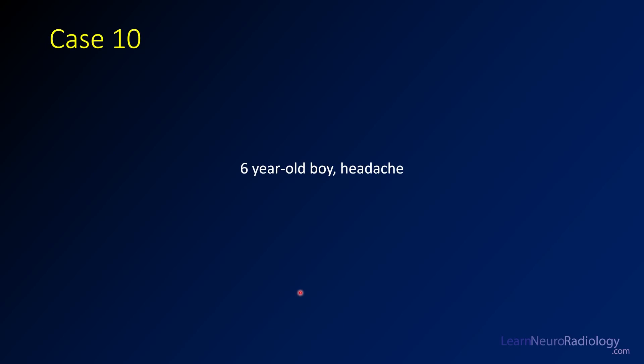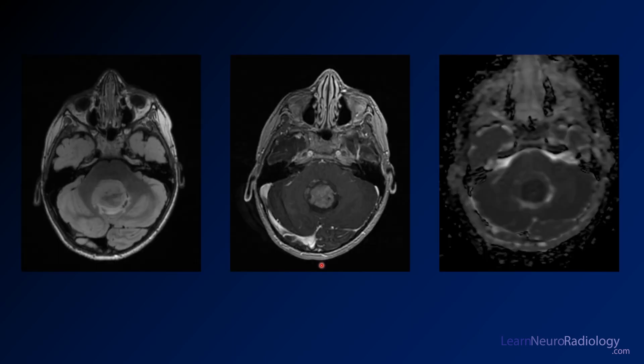Welcome back to Learn Neuroradiology. For case number 10 of our brain tumor board review, we have a pediatric case — a six-year-old boy presenting with headache. We have some images from an MRI through the posterior fossa of this six-year-old boy. This is a FLAIR image, this is a post-contrast T1.